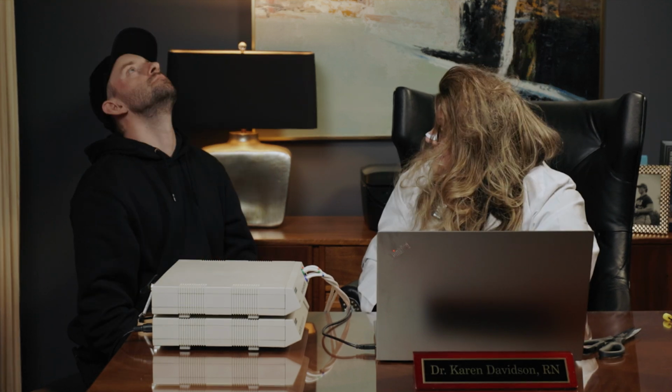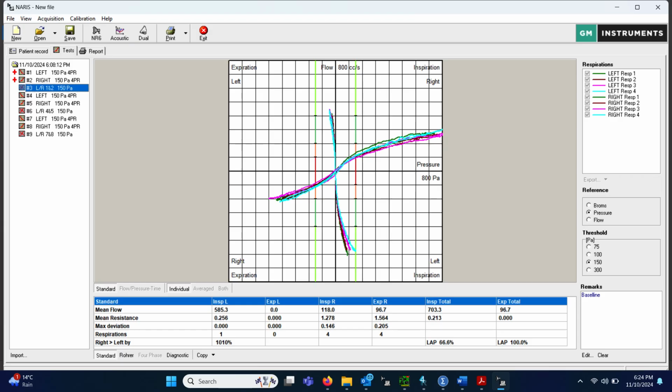It takes about 15 seconds to calculate. So when I look at the test, you can see the right deviated septum. I see the right side here? See how lower it is to this side? See how uneven the X is? This tells me I see a right deviated septum. I also see some of a nasal valve issue.